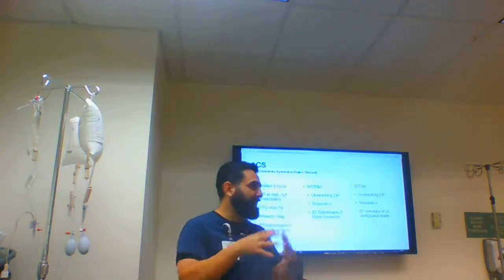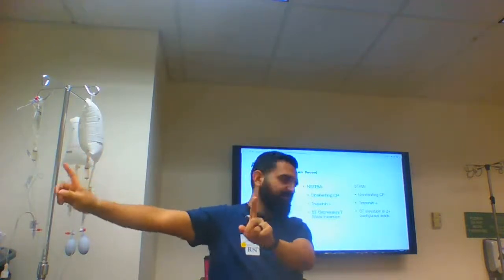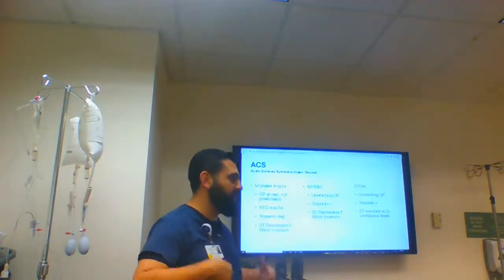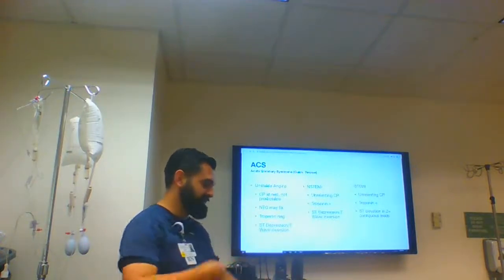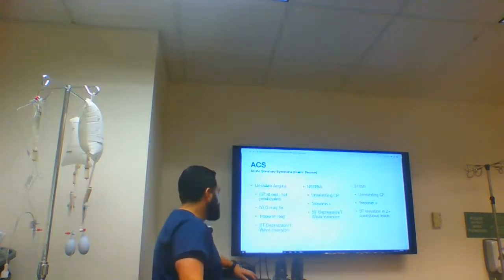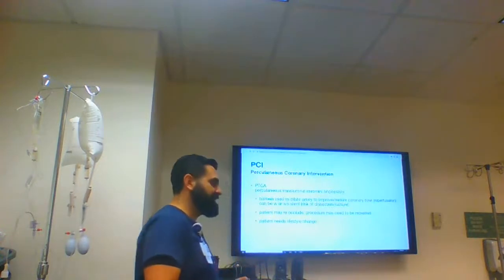The closest we've gotten is where you connect all the wires together here, and then the whole module is wireless, and you can keep the EKG machine outside. But all the wiring is still there. Even with the telebox, it's still wired to the patient, and then the telebox itself goes to whatever antennas. It needs to be in constant communication, and it's very important that you know lead placement, right? But we're not here to talk about lead placement.